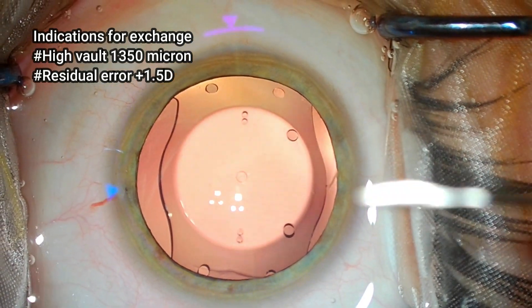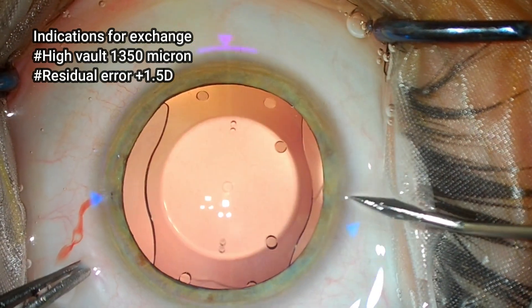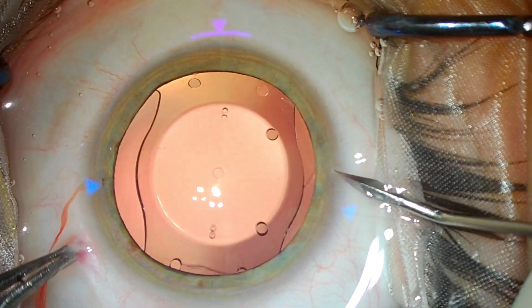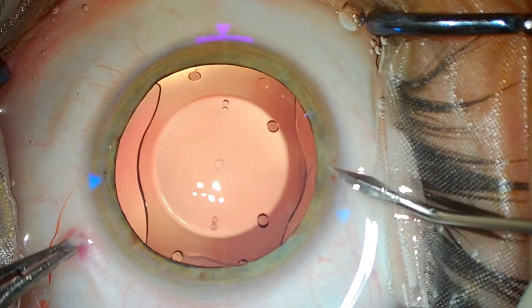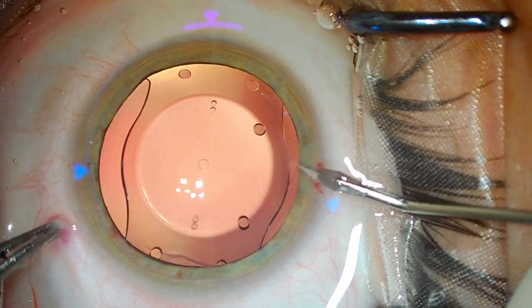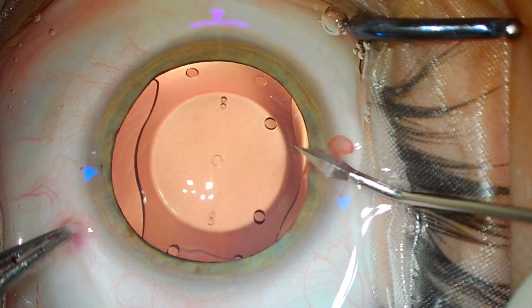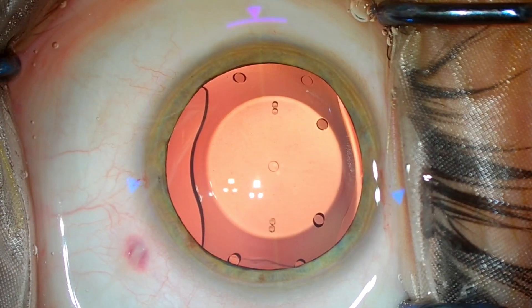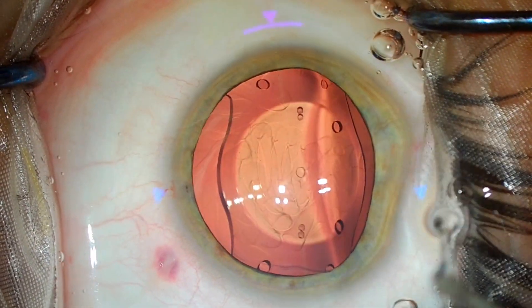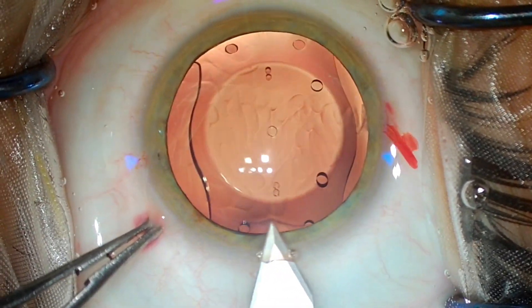This is the second case where I have to exchange the IOL because of a high vault of 1300 microns. There was a residual refractive error because of the high vault, and the patient had no complaints as such. I decided to exchange it because I didn't want a larger pupil — whenever you have very high vault, you may have a larger pupil than the other eye and may have some dysphotopsia. Also, the angles were a little narrow. So to address the residual error and the high vault, I re-ordered the IPCL.